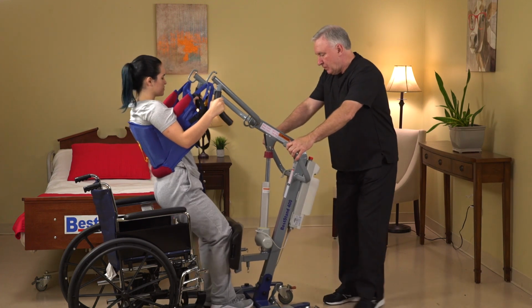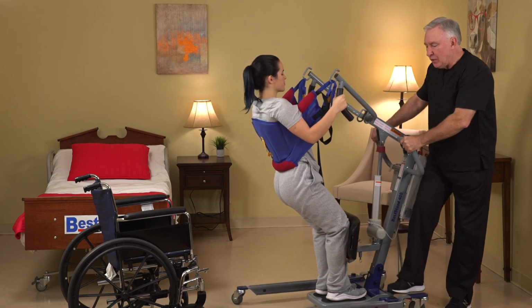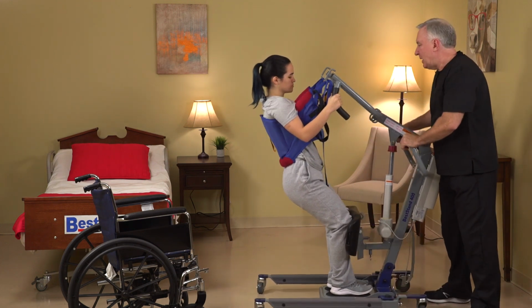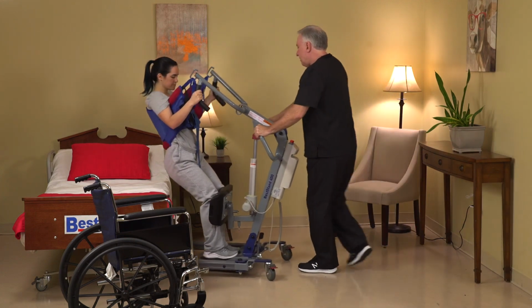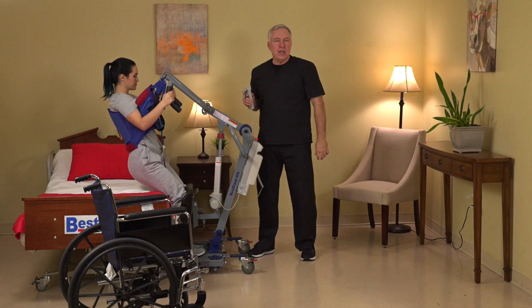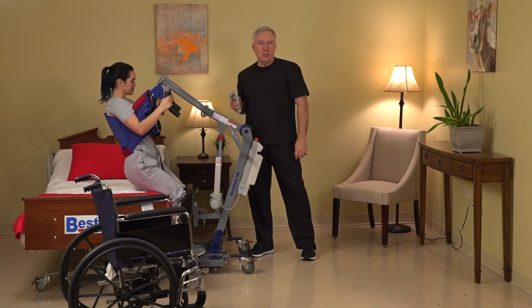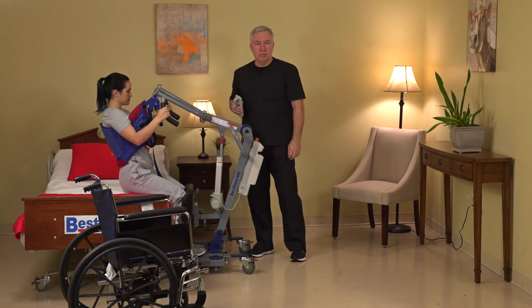Unlock the wheels. Of course, we can close the base to make it easier for us to fit it into tight spaces. Take the patient over the bed. And now lower the patient down on the bed into a seated position. So that's how we make the transfer from the wheelchair to the bed.